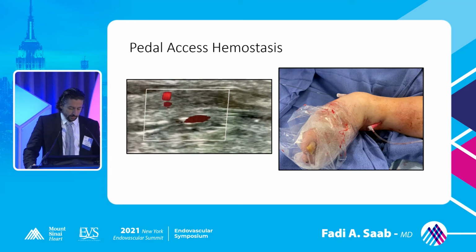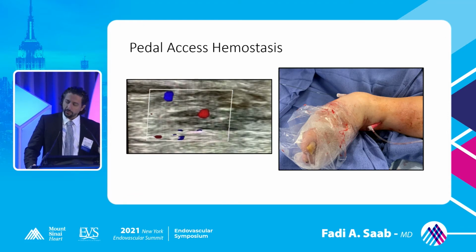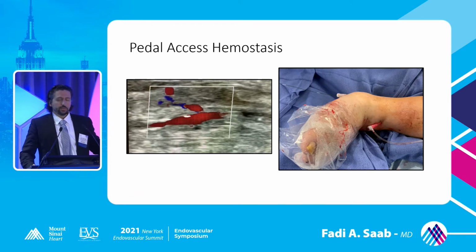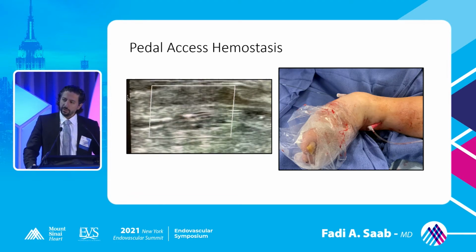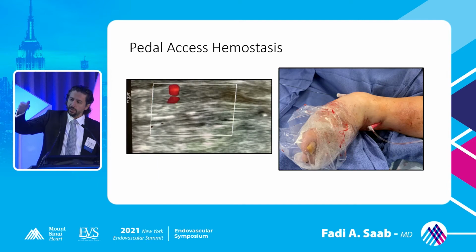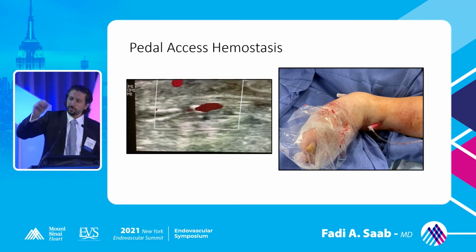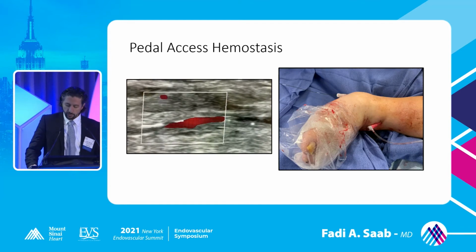How about pedal access? So we do a lot of a TAMI technique. My next talk is going to be about that. So we do ultrasound-guided modulated closure of access sites. So our ultrasonographer will hold the probe, the hockey stick probe, and actually monitor the flow beyond the access point, making sure that you're not occluding the vessel completely.